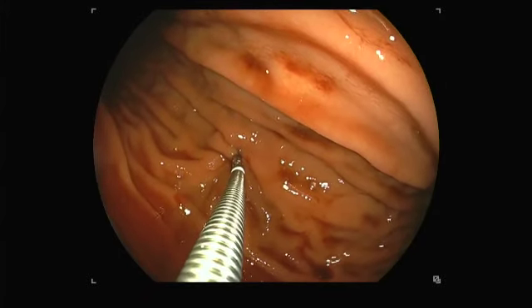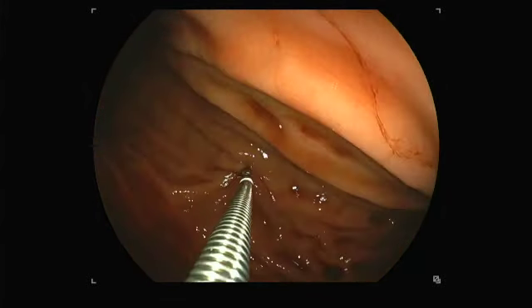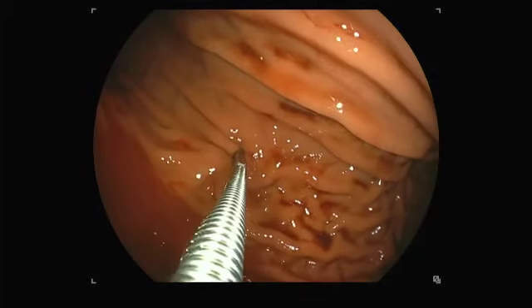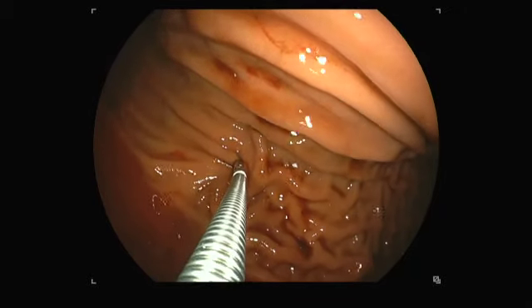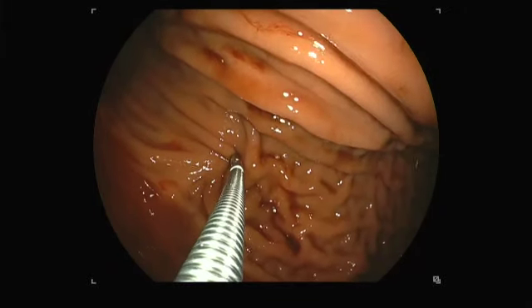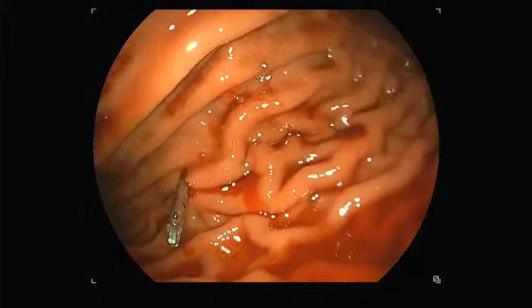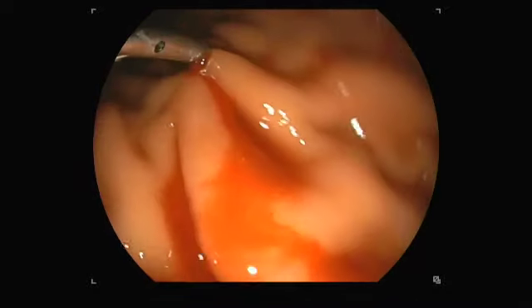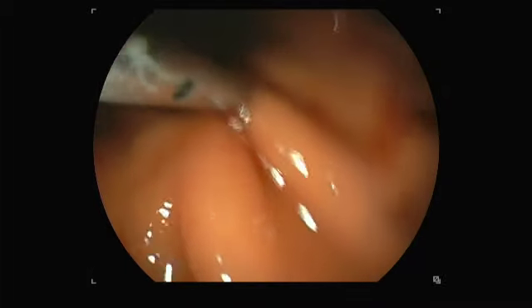One, epinephrine injection, but you will cause more damage with more punctures. Cautery is not an option either because of risk of delayed bleeding from the ulceration. So mechanical hemostasis is the way to go. You could also consider a spray, but it is going to be temporary. So we decided to apply a clip on that bleeding spot.